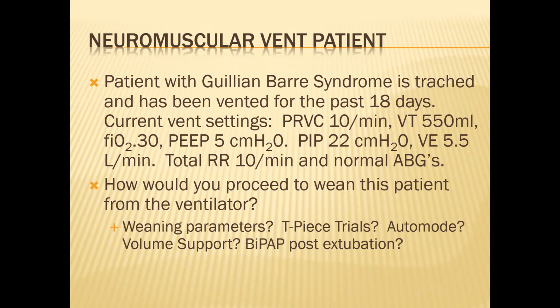So it gives you the current ventilator settings. How would you proceed to wean this patient from the ventilator? Okay, so some pressure support trials?